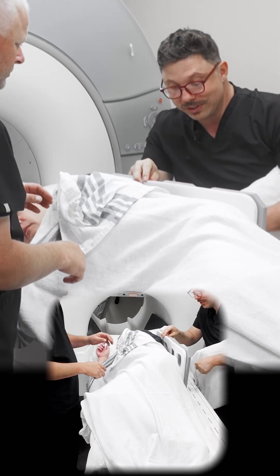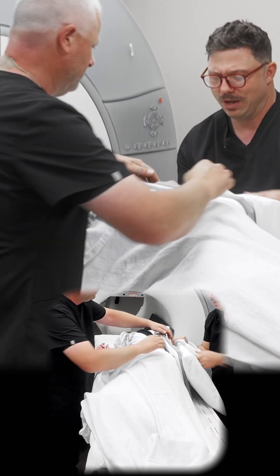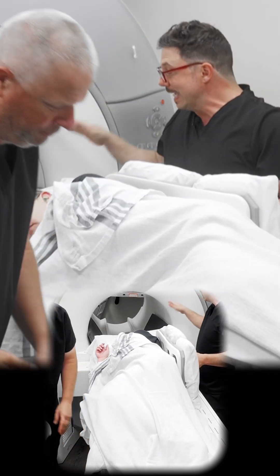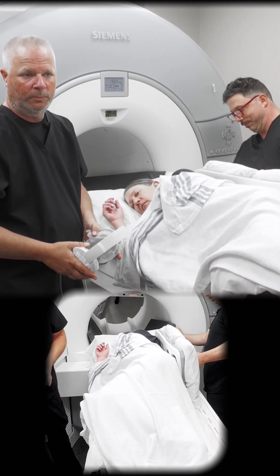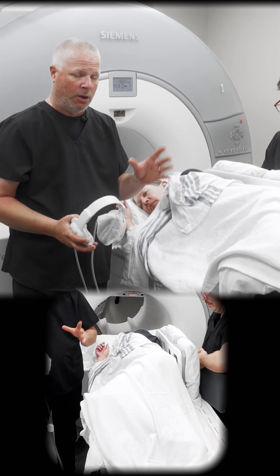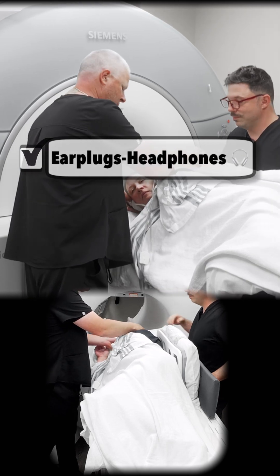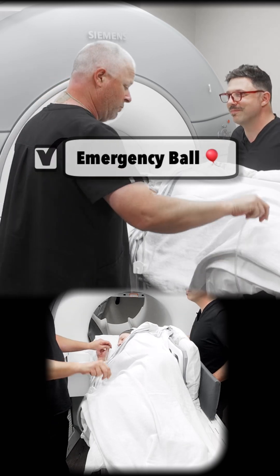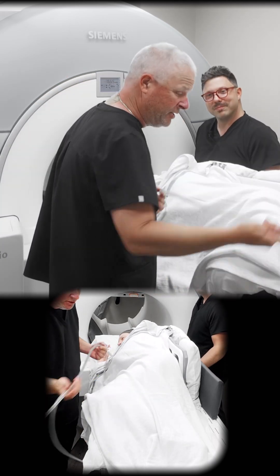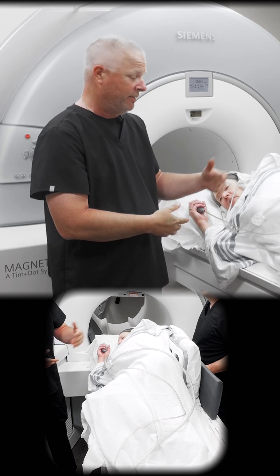It's important to make sure that the cable doesn't touch the patient directly or coil touching the board. We're also gonna place a pillow right behind her back with that 18-channel coil so while she is in the magnet she can lean back into it, keeping the coil in its proper placement. Once everything is positioned, I'm gonna go ahead and add the headphones for extra protection, and most importantly the emergency squeeze ball, because we want constant contact with the patient — especially patients that are in a lot of pain and can't hold still.